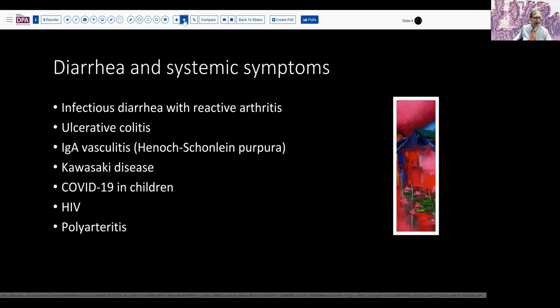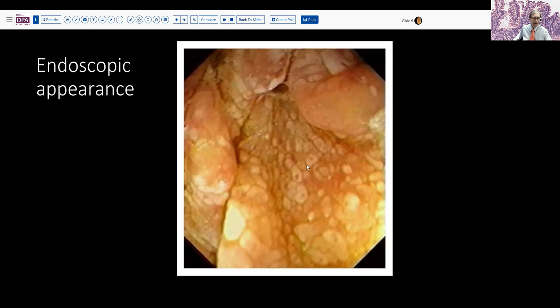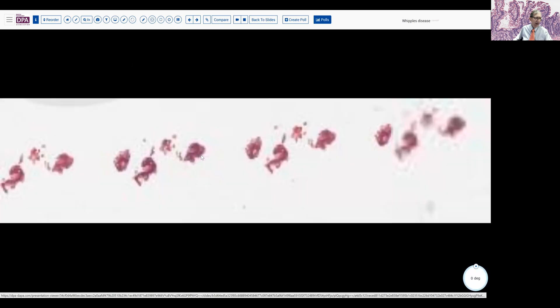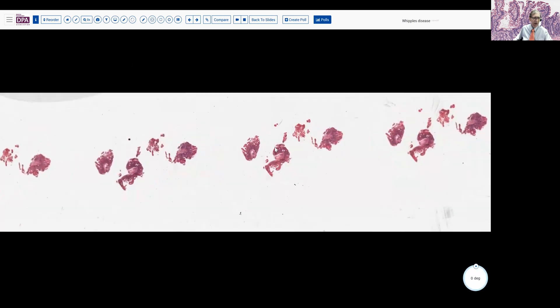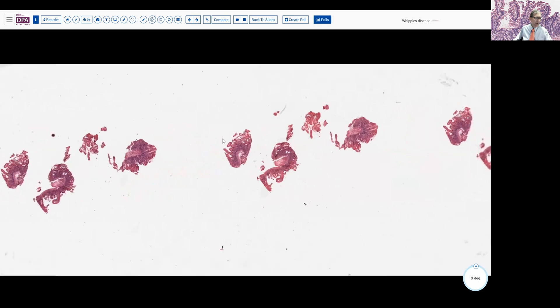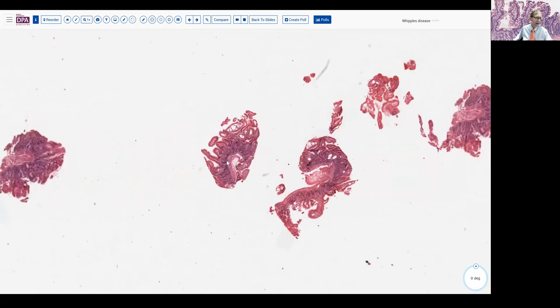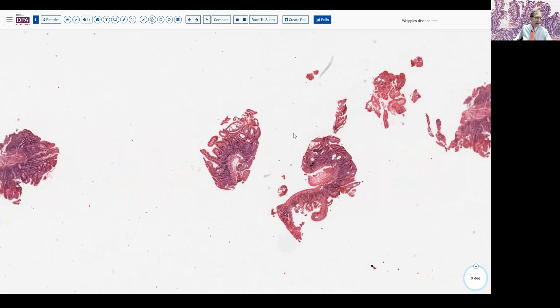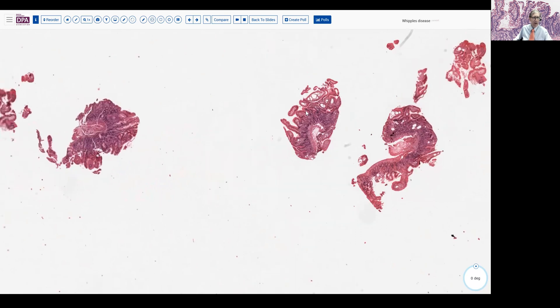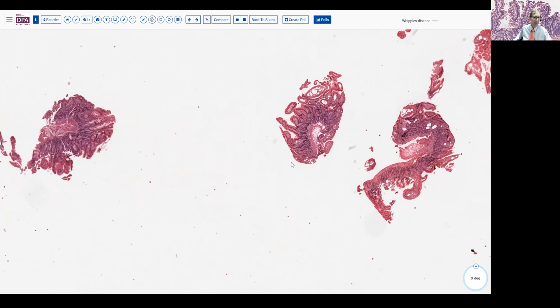On endoscopy, this patient had several slightly plaque-like areas, a little bit punctate, focally ulcerated perhaps, not very specific, but suggestive of some sort of a multifocal, slightly infiltrative pattern. Looking at the digital slides of our biopsies, we see these are not particularly blue. We're in the small bowel, as we've indicated. And as we look at these samples, we'll take a look on higher magnification to see what's going on.